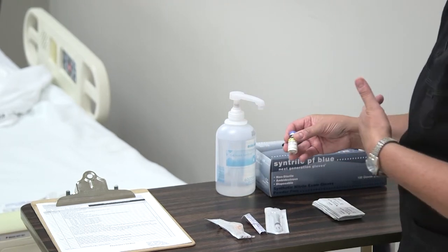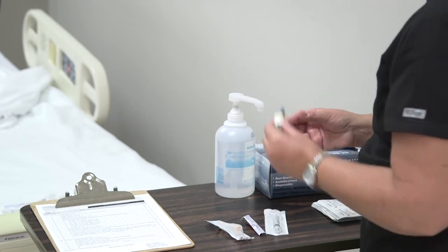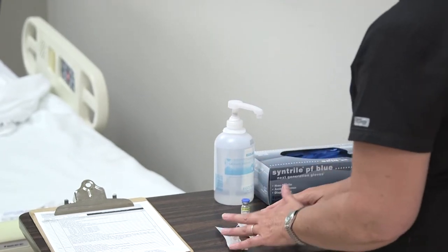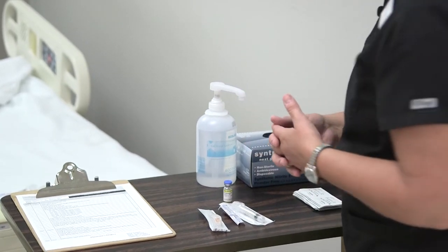before I go ahead and do my three checks, because otherwise you don't have the accurate dose, you just have a vial. So I'm going to go ahead and show how we draw up the dose, and then that's when we would proceed to do our medication checks.